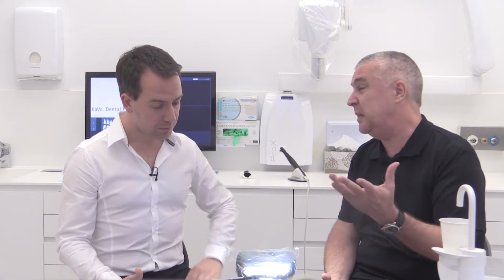No, look, and I think there are also incarnations of compatible software that allow you to deactivate the ring switch, but I think that's probably something to talk to the Henry Schein rep about. Yeah, I would have said so. In that sense, the technology that I work with, I say to my dental assistant who's standing next to the computer, click, and that's when he or she can capture the image for me. Yeah, I would probably bet that in the future there may well be something like a wireless foot control, because using foot control all the time, it's easy for us to go click click click with the foot. So that might be something that, rather than squeezing a switch and trying to hold the handpiece at the same time, people may find a little bit more convenient, and wouldn't be difficult to do.